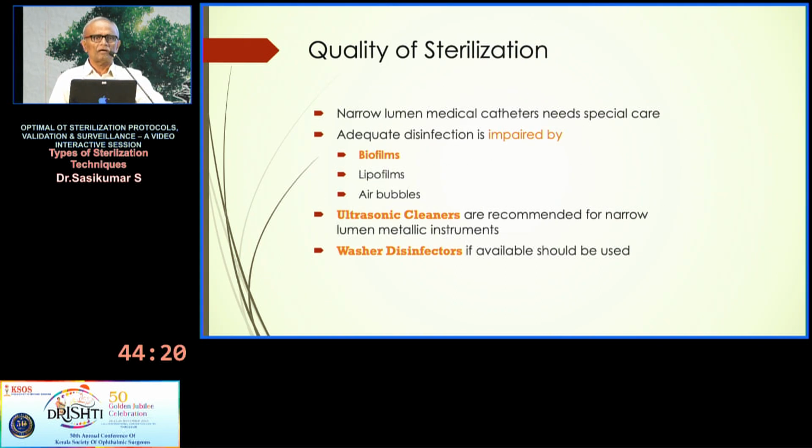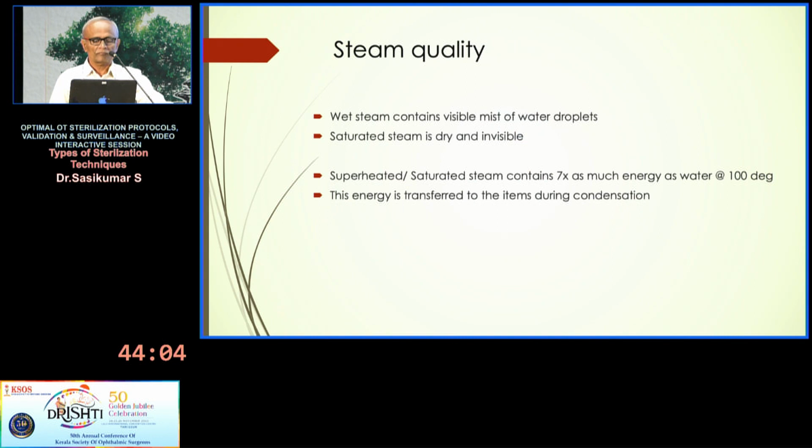Narrow lumen cannulas require special attention. Long tubing, especially the phaco tubing and vitrectomy tubing, also requires special attention. Ultrasonic cleaners are recommended for efficient cleaning of narrow lumen cannulas and serrated instruments.